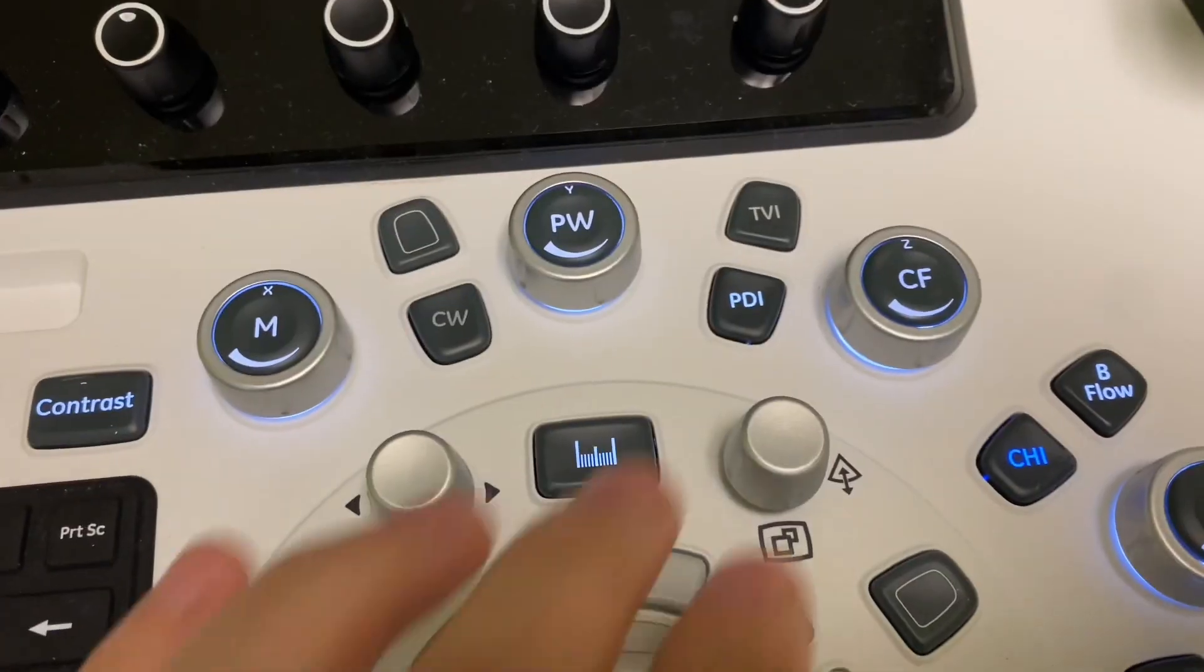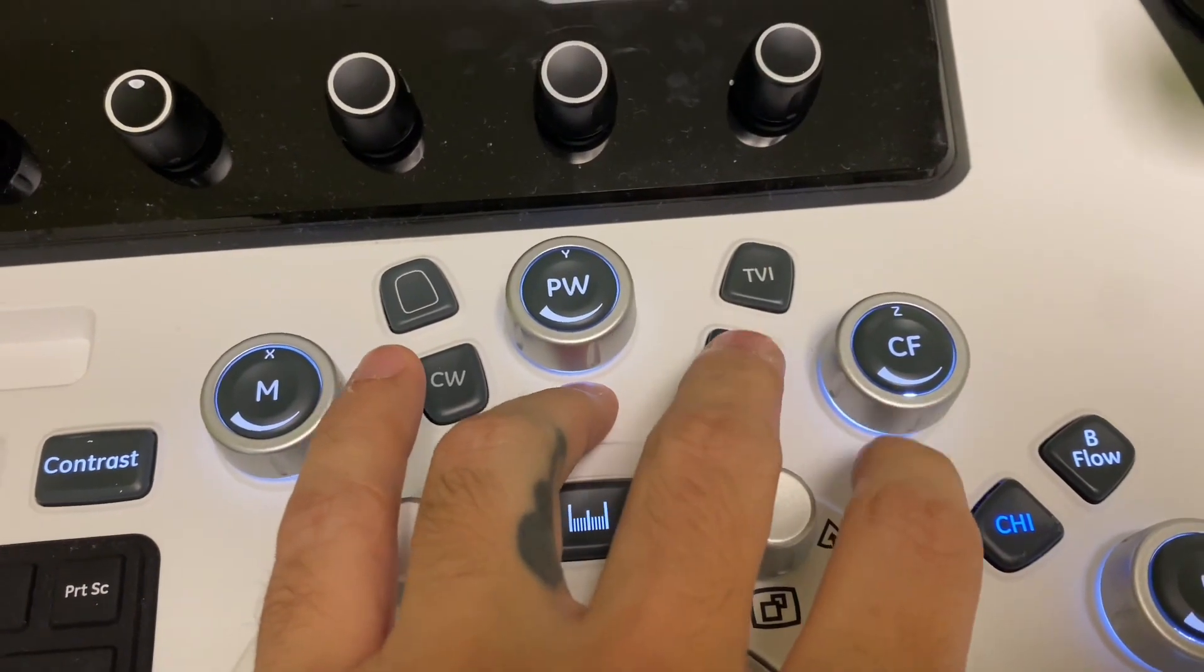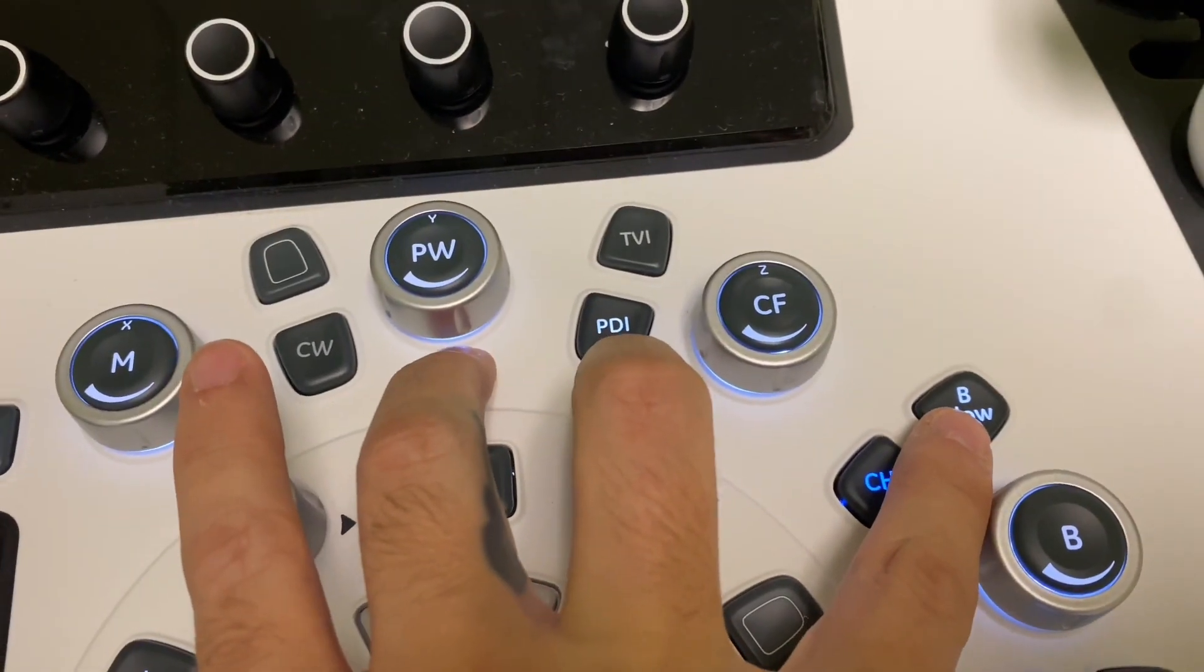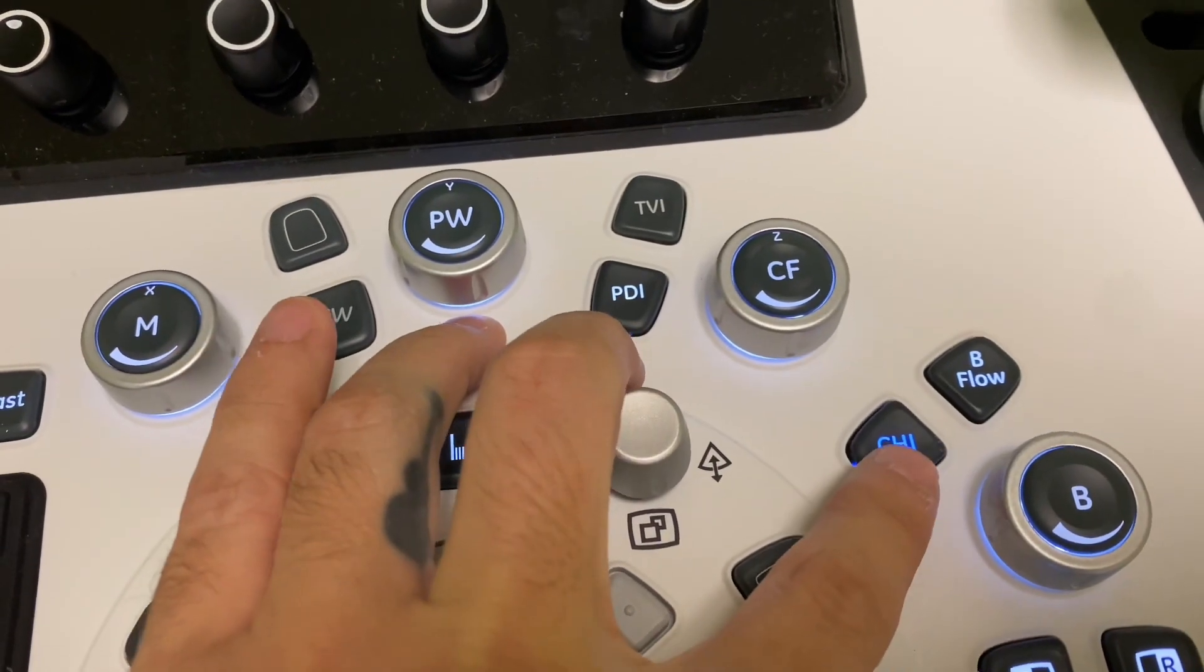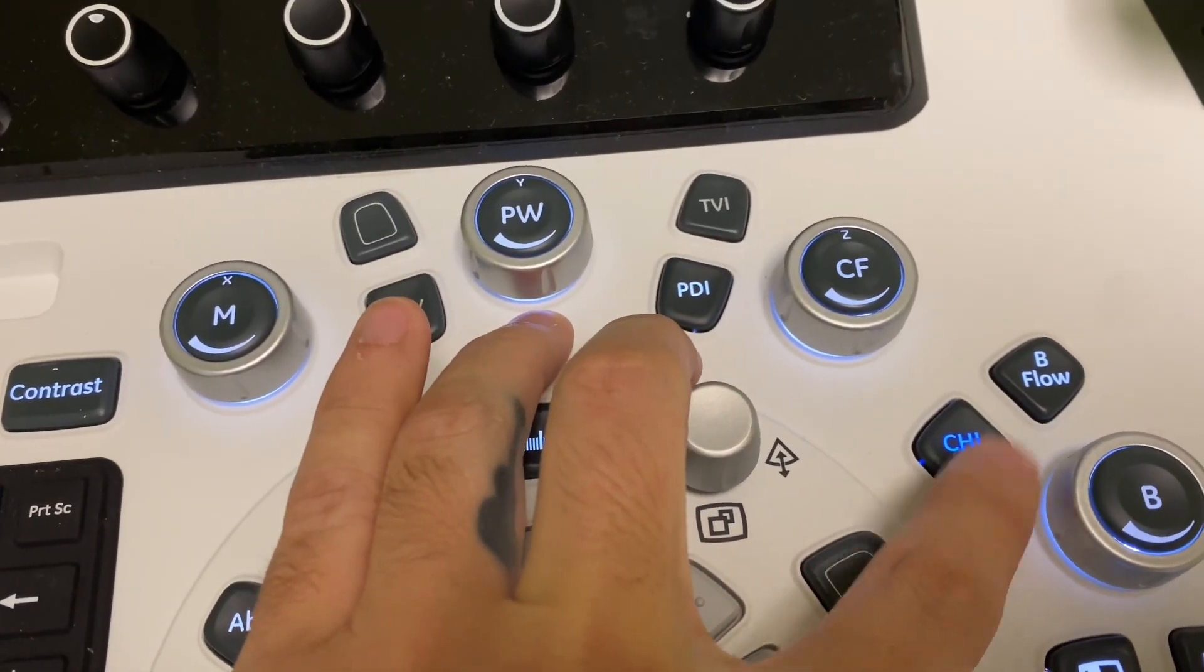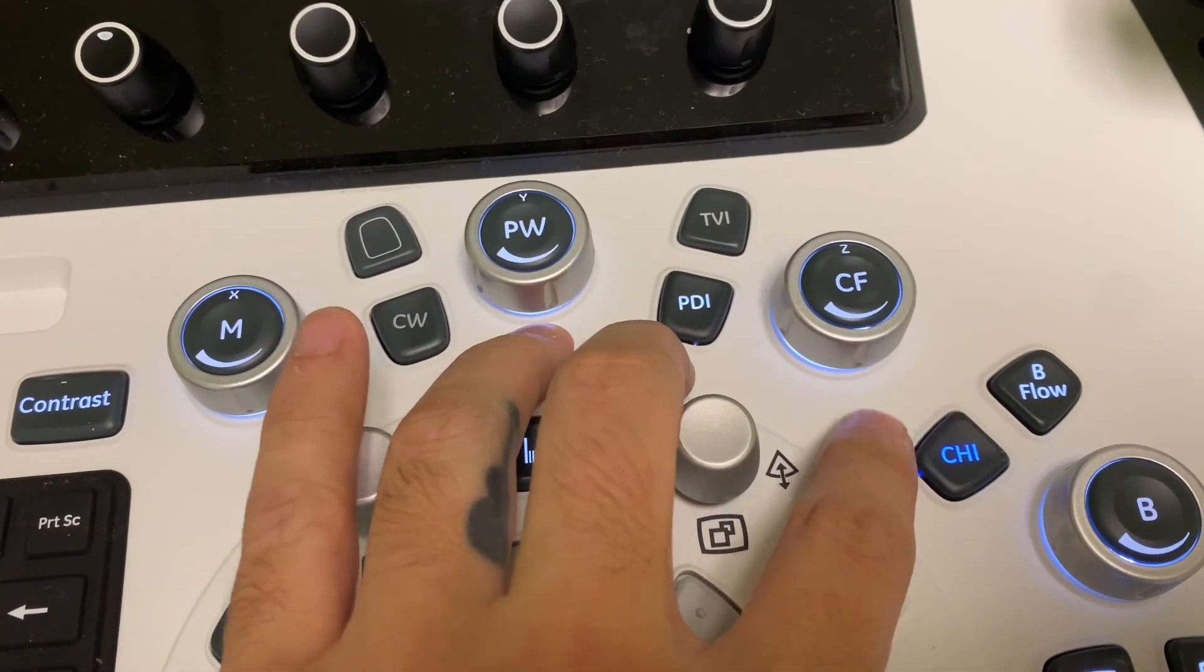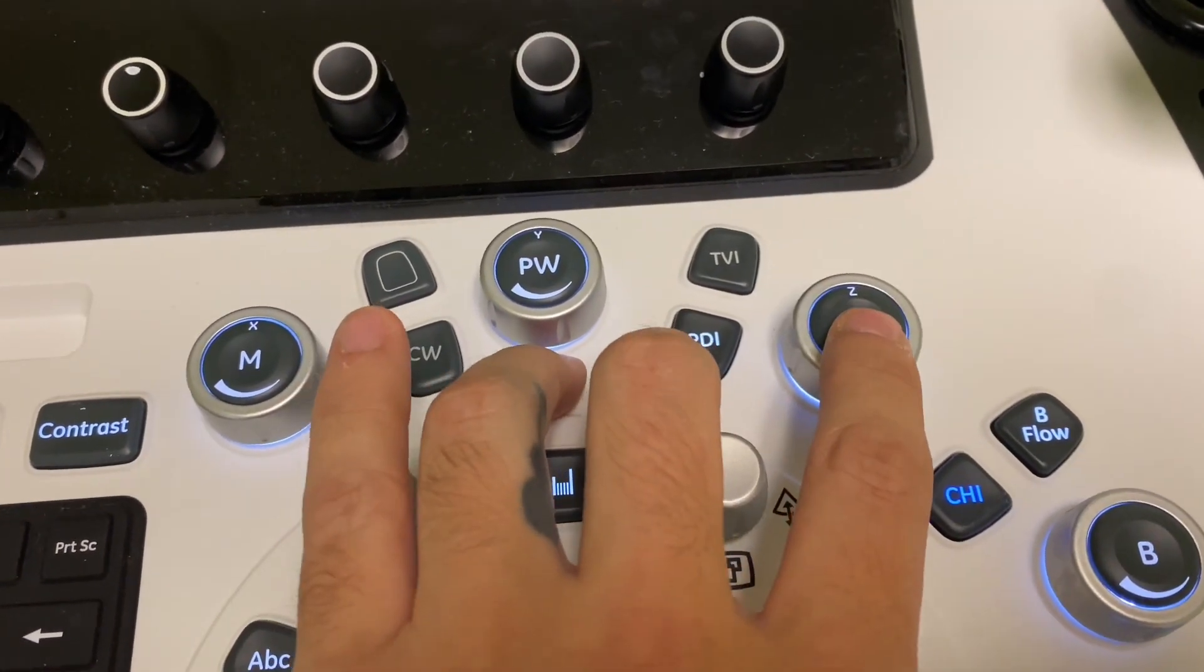So you have power Doppler, which we use a lot, or I use a lot at least. B-flow, which I use a lot as well. And then harmonics, turn it on or off. I usually always have it on. Sometimes I'll turn it off depending on the patient we have.